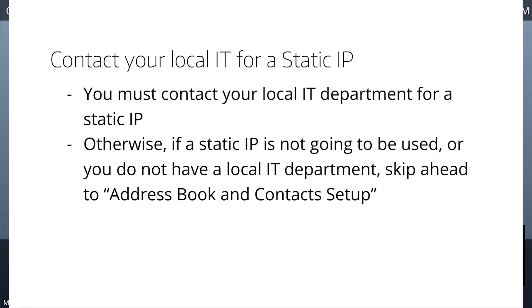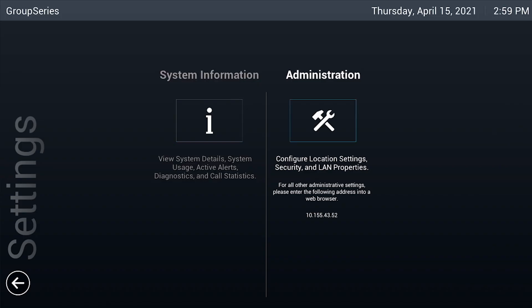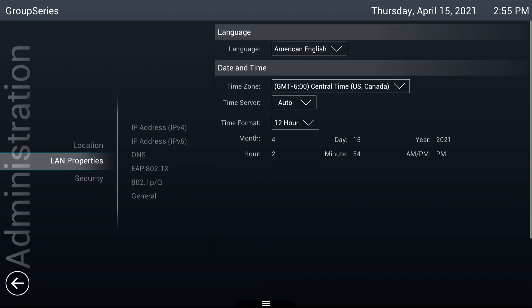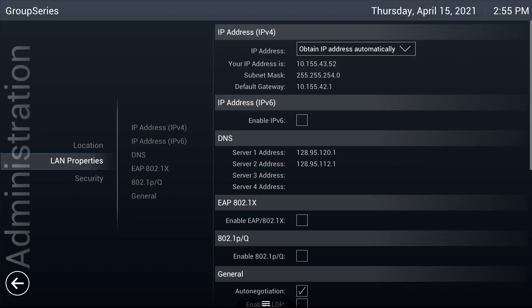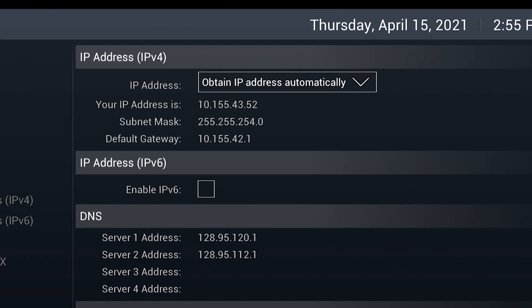To start, tap on the menu button, then navigate to Settings. Select Administration and enter the admin credentials. Next, tap on LAN properties and then IP address, IPv4.